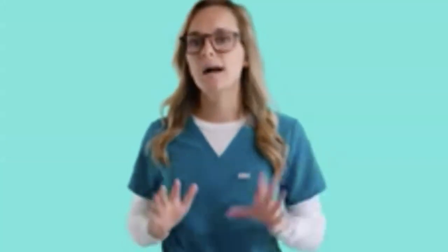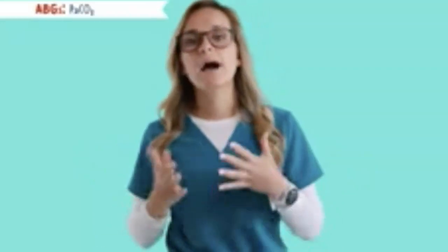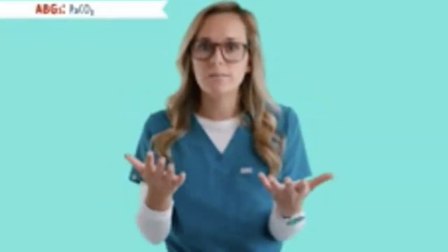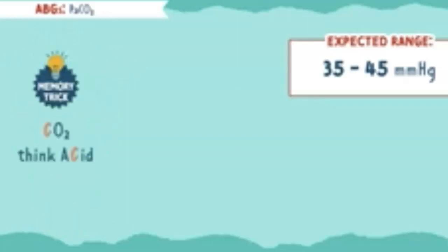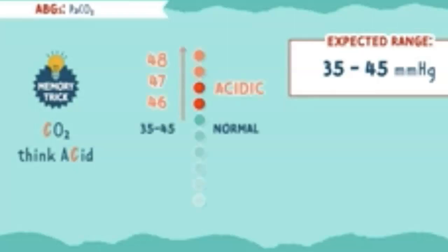Next on the list is carbon dioxide, written as PaCO2. PaCO2 is a measurement of carbon dioxide in your blood. This is a reflection of how well CO2 is able to exit the blood and be exhaled, thus maintaining a normal pH. A normal CO2 is, do you remember? 35 to 45. Now CO2 is a little different than pH. CO2 is acidic. You can remember this by the memory trick, CO2 is an acid. So the more CO2 you have, the more acidic your blood is. The less CO2 you have, the less acid you have in your blood, meaning it's more basic or alkalotic.